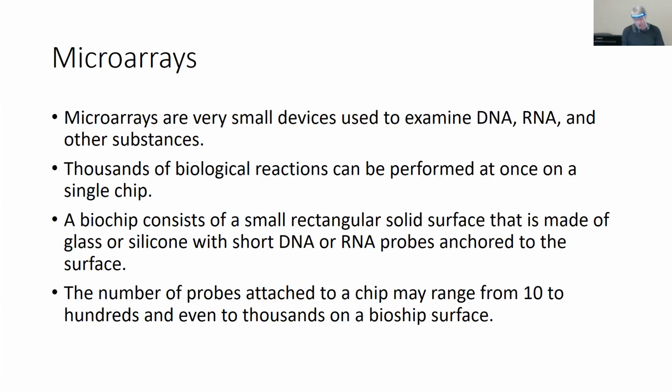You have a little lid you open up, and you place a little pouch in it and close the lid. So it's about this big. Okay, that's one unit. And then, of course, it's got a computer attached to it. This is the lid, and you do all your processing right here, loading the pouch. Very simple, very easy. You take your little sample, add it in there, load the pouch, and put the pouch into the microarray. So it has thousands of biological reactions performed at once on a single chip.